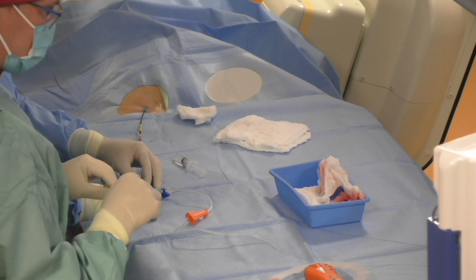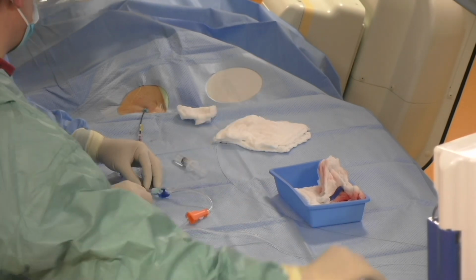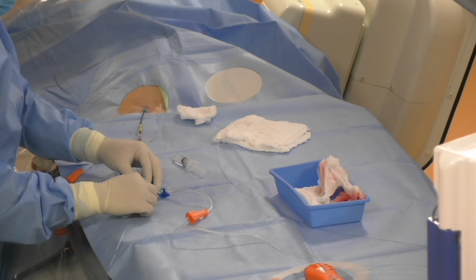Now we take the fourth coil. It's a very, very soft coil, a nano coil.